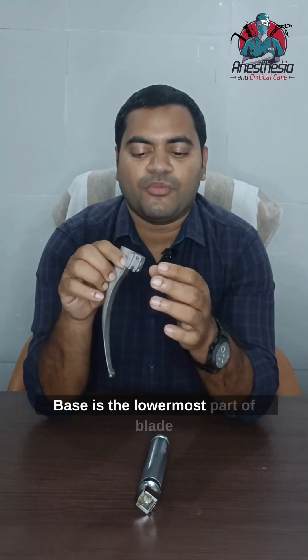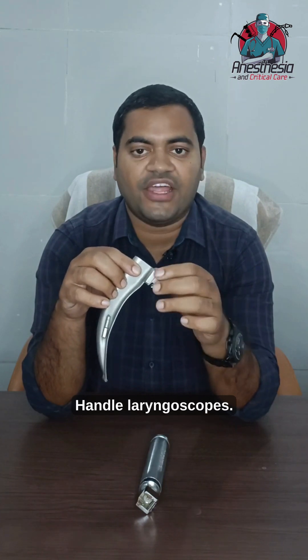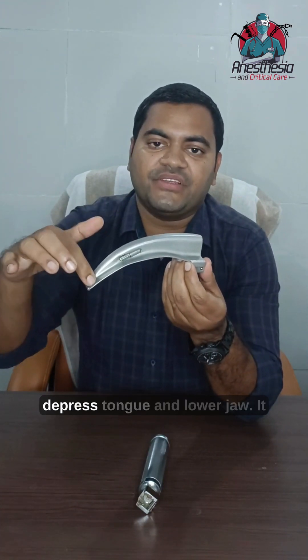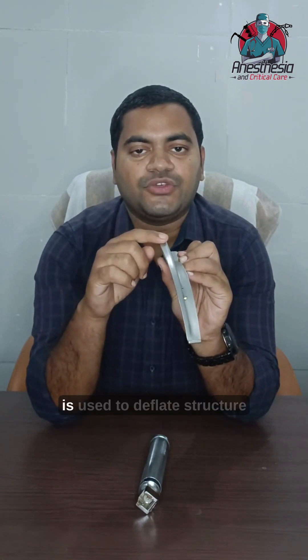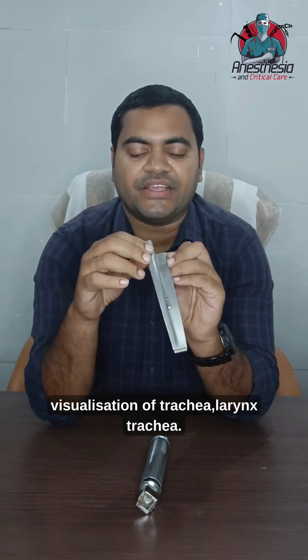The base is the lowermost part of the blade, which has a heel used to attach the blade to the handle of the laryngoscope. It has got a tongue which is used to depress the tongue and lower jaw. It has got a flange which is the sideward projection of the blade, used to deflect surfaces in the mouth for visualization of the larynx and trachea.